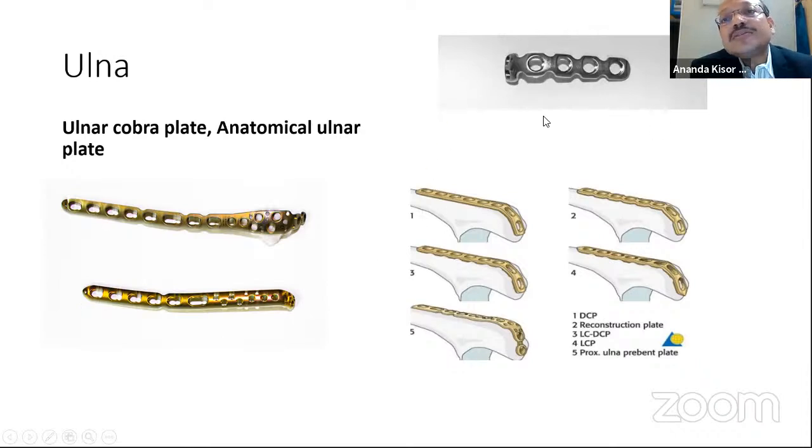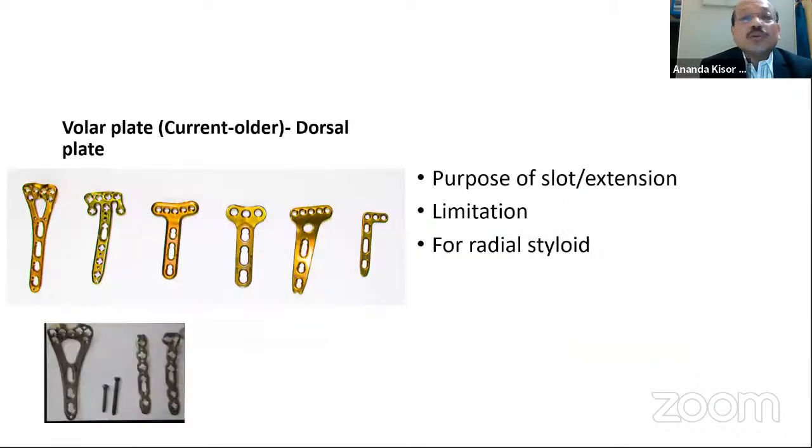This is another low profile proximal ulnar locking plate. You can see here there are two screws. Those screws can be introduced to the tip of the olecranon, and these should be conical screws. See, the holes are conical. So the screws are engaged in the hole, and that doesn't cause any micro motion.